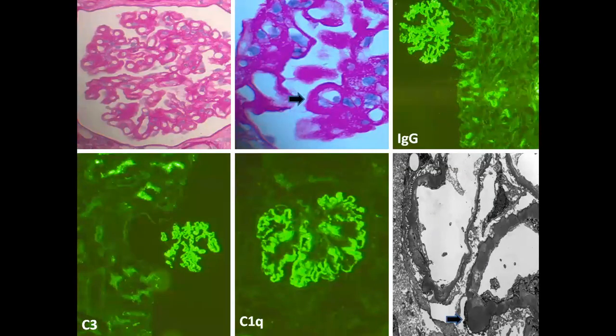On morphology, you are seeing glomerular capillary wall thickening. Occasional wire loop-like deposit is there. IgG shows granular staining, and also extraglomerular staining is seen along the tubular basement membrane. If you see extraglomerular staining, it suggests that most likely we are dealing with an autoimmune kind of disorder. C3 was there, C1q was strong. So everything fits. Even the morphology raises the possibility that I am dealing with a secondary membranous.